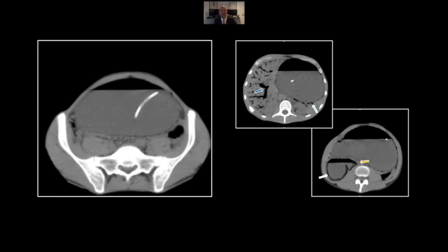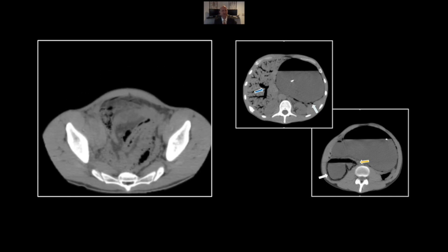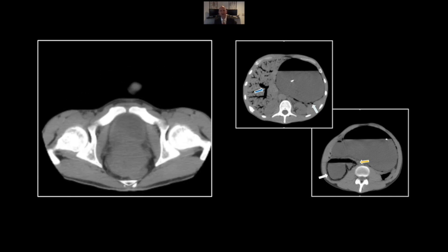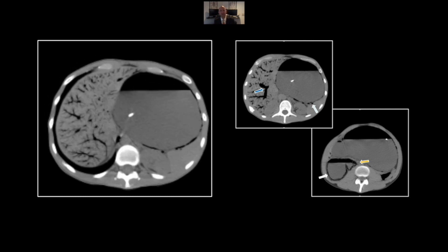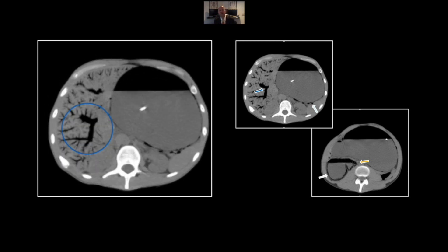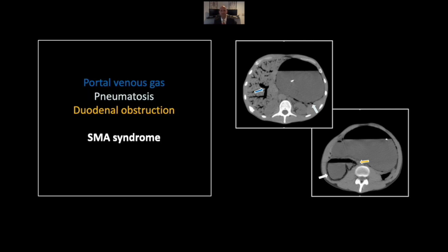Typical in cachectic patients. Rather spectacularly, this patient did survive. That is SMA syndrome with obstruction, ischemia, and portal venous gas.